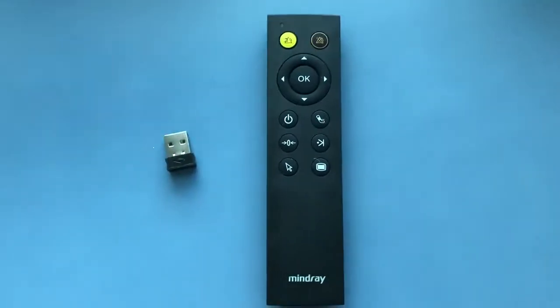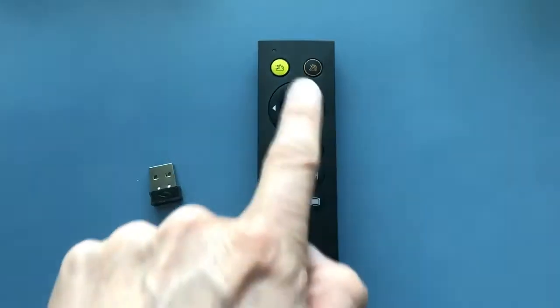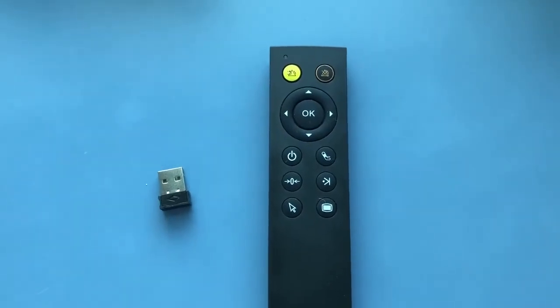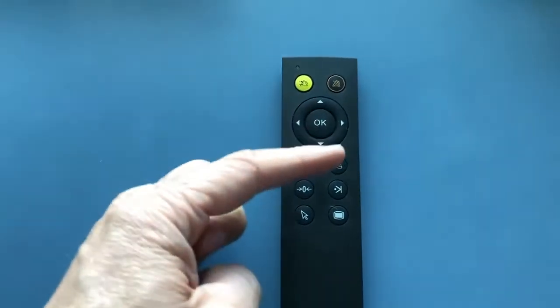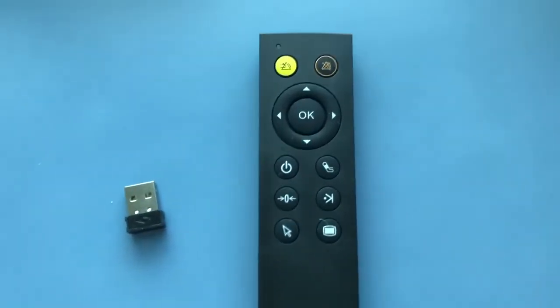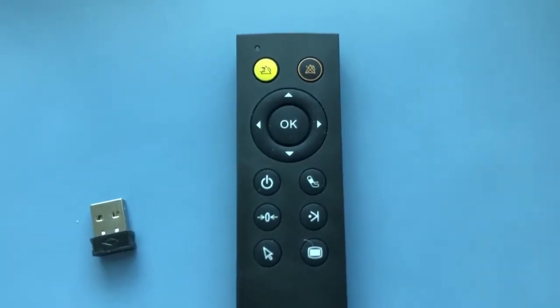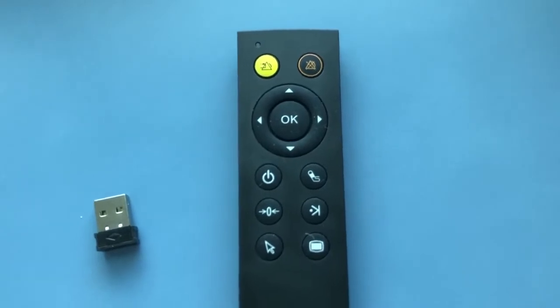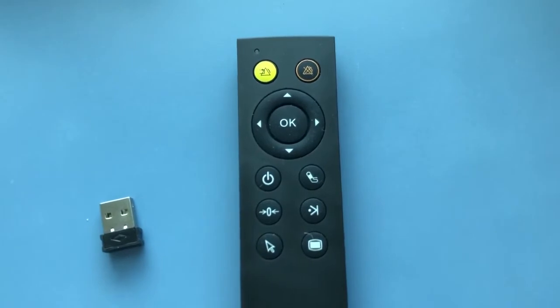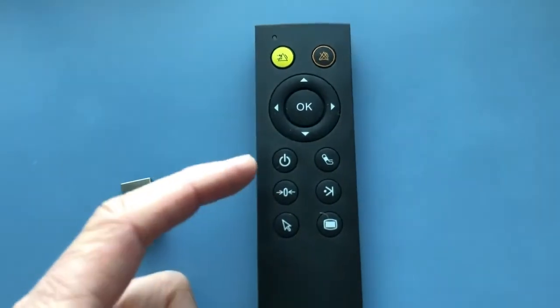Working from the top of the remote control: the yellow button and the orange button correspond to alarm presets. The alarm reset is the yellow button, and the red one is the alarm pause key. You've got up and down, and left and right. Left and right work like swiping on the screen — swiping left and right gives you the different screen layouts. Up and down is for when you're in the menu: you can navigate up and down and push OK to register your selection. Further down, there's a standby key.